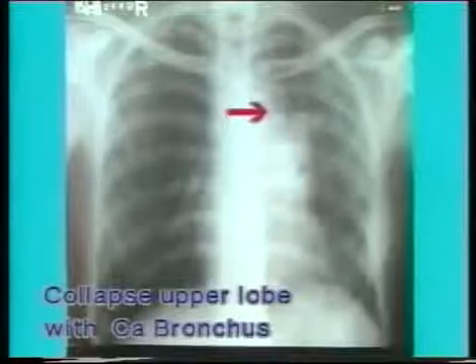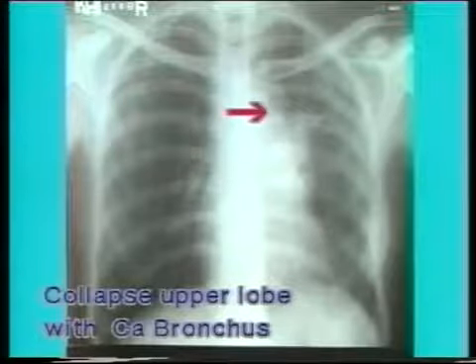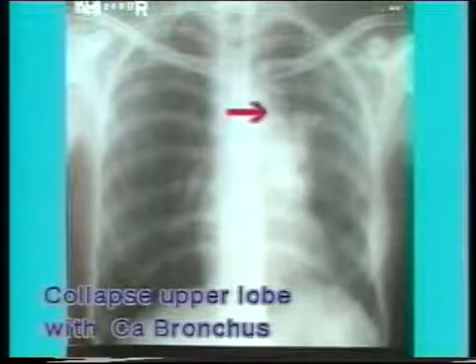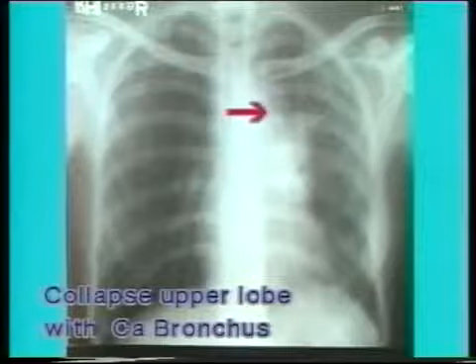If the bronchial obstruction is complete, the affected segment or the lobe collapses. The atelectasis may be sharply defined, or if it is incomplete or mixed with consolidation, then its presence will be indicated by a raised diaphragm and crowding of ribs.